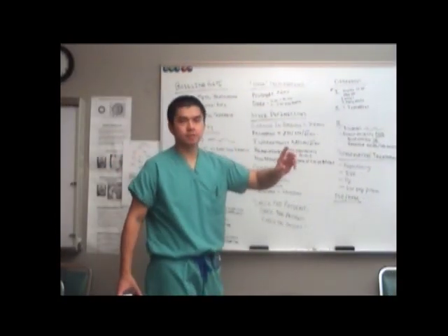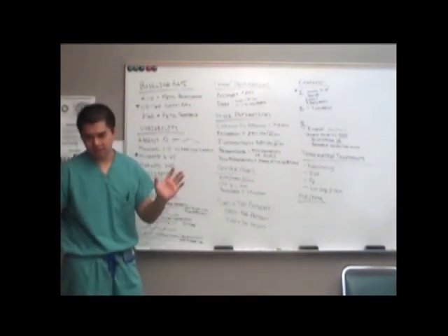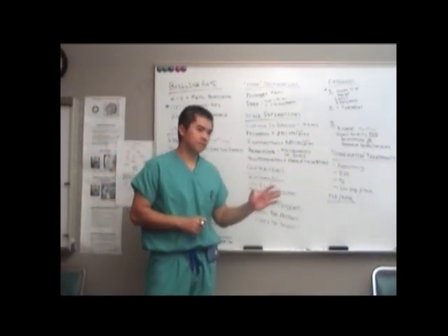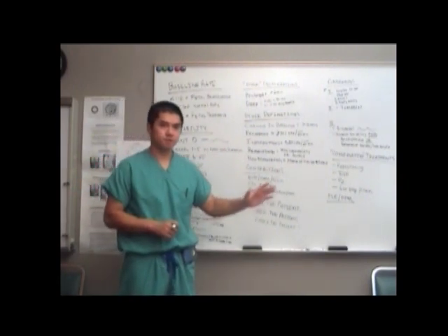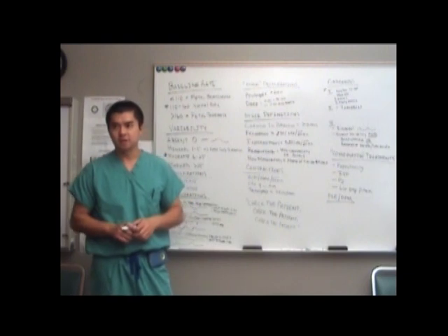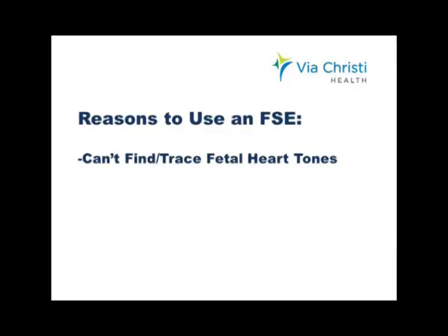One of those reasons is not because the nurse can't find the baby on the monitor. If that's the reason, then they should have failed after trying multiple times, also another nurse failing. So if you truly can't find the fetal heart tones or can't trace it, then you can put an FSE on.